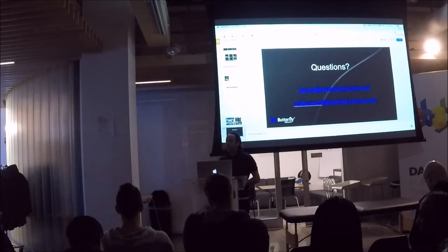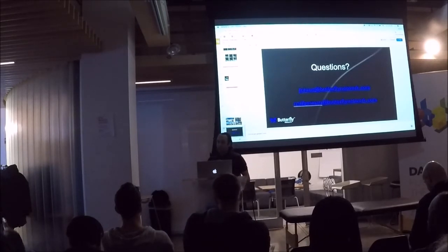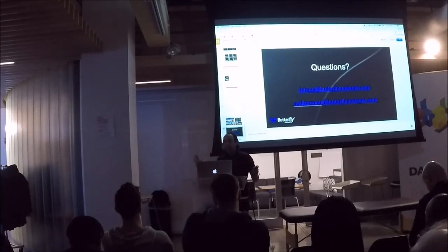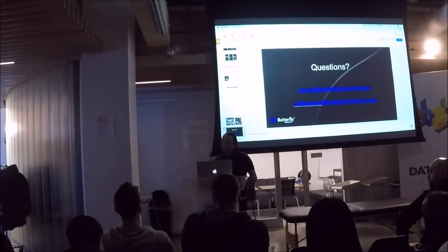Yeah, exactly. Think about it this way. If you only have a classification label, like is this a heart image or a lung image, what the generator can do is take a source heart and make it a lot bigger. Totally plausible, it's still a heart. But if you train a segmentation at the same time, that segment in the source domain is not going to line up nicely with that fake heart, right? Because it's so much bigger all of a sudden. So the generator, in order to satisfy the segmentation loss, is going to have to correct that enlargement of the heart.